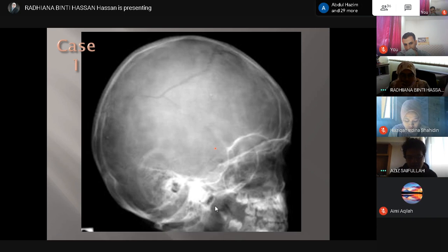Yes. Is it like, say, this is a plain radiograph of a pediatric patient?